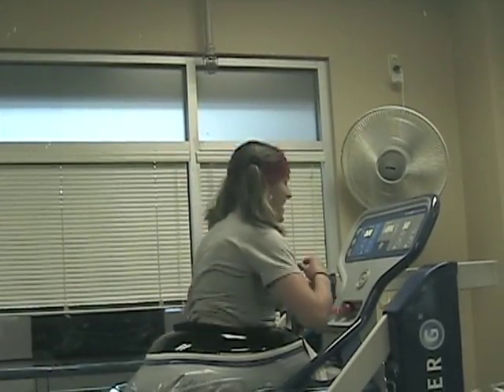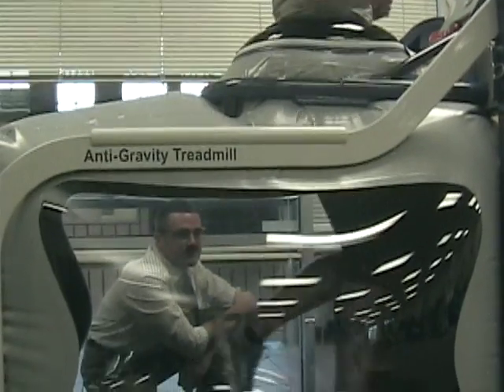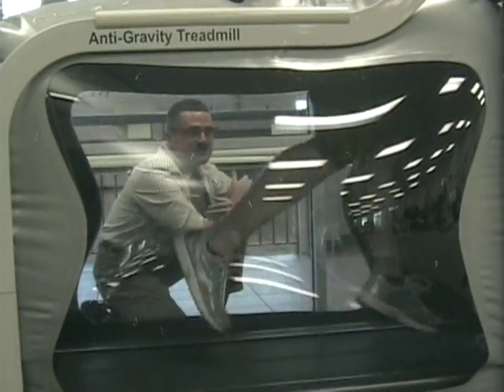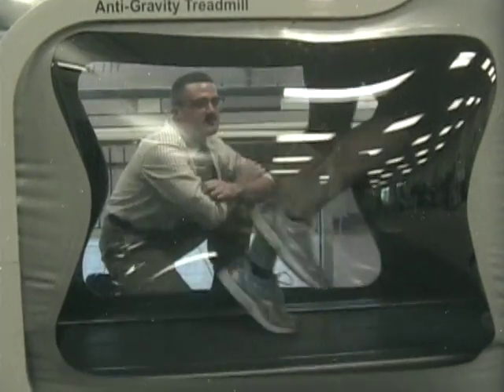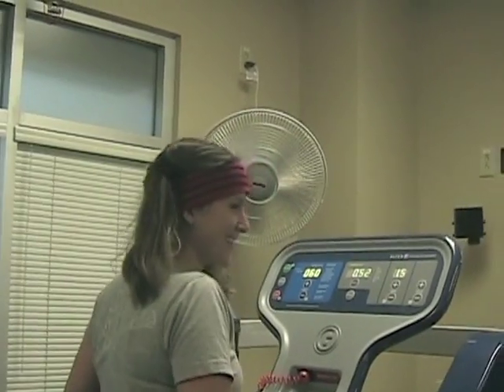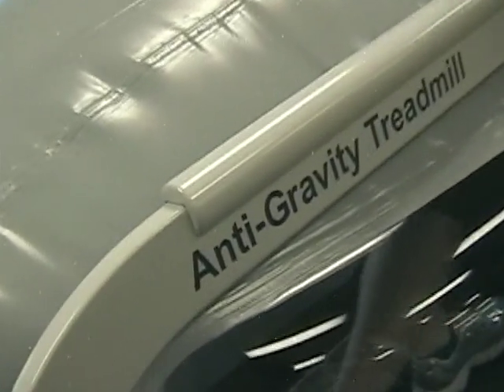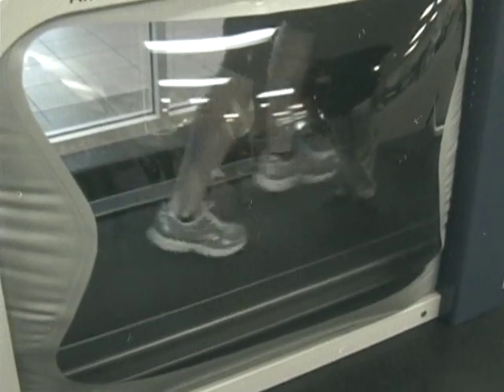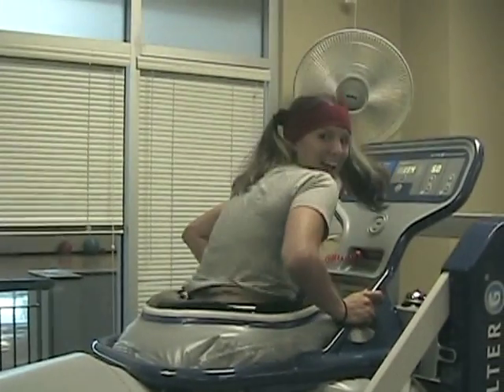This is one of the most advanced body weight support systems available: the Alter-G. The Alter-G is considered an anti-gravity body weight support system and works via differential air pressure technology developed by NASA. There is no harness with the Alter-G. Instead, the patient uses shorts that have a zippered skirt. The skirt is then zipped into the system, creating an airtight seal around the lower extremities and treadmill. Once the differential air pressure technology begins, the patient's body weight is supported to the predetermined percentage.